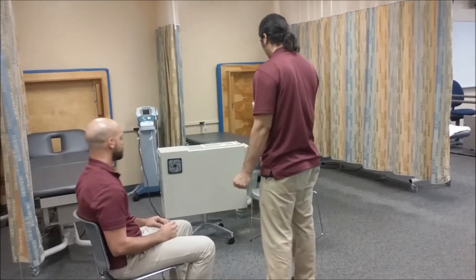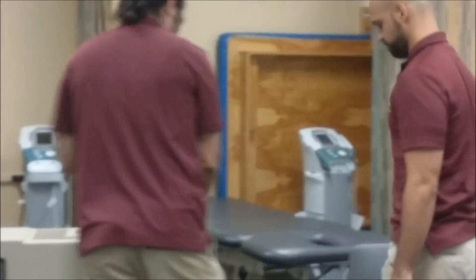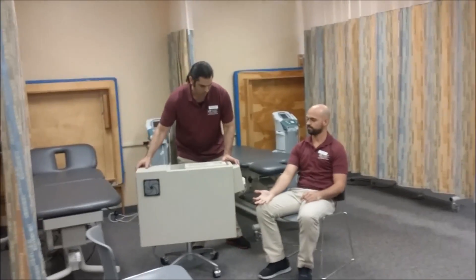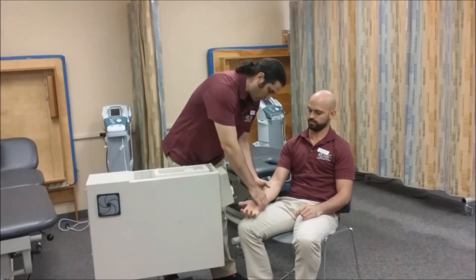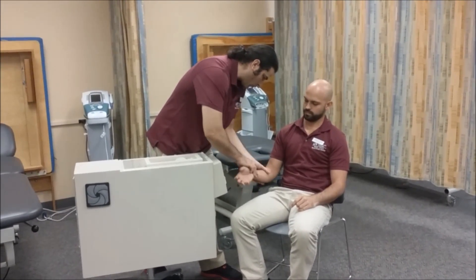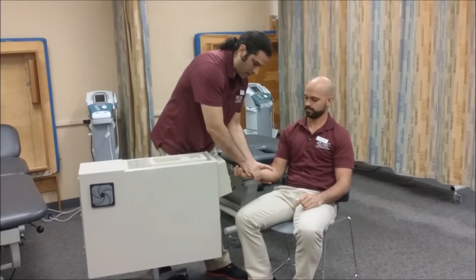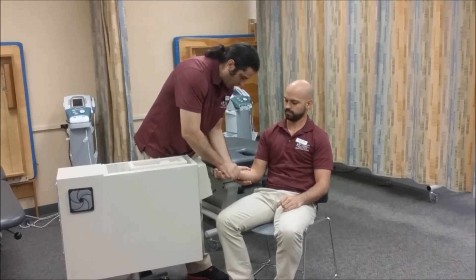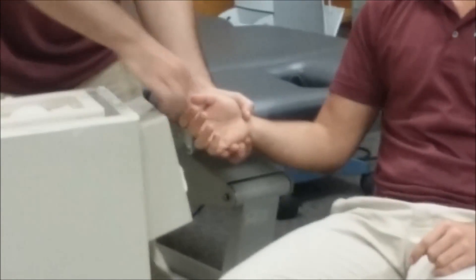OK, come with me. Before starting the treatment, I'm going to assess your skin to find if there's any scratches or open wounds. Everything looks OK. The hand and arm should be washed beforehand. Can you feel it? Everything looks fine.